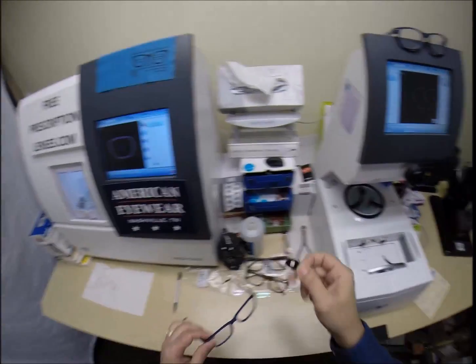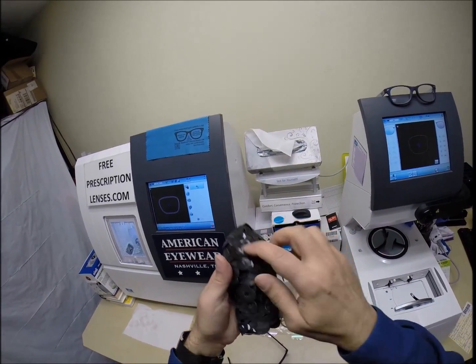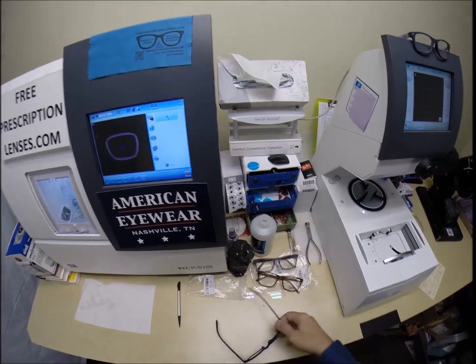So, I've taken the block off, I'm taking the sticker off, I'm collecting them, I'm making a monster. This is going to turn into a great work of art one day, but nothing gets thrown away.